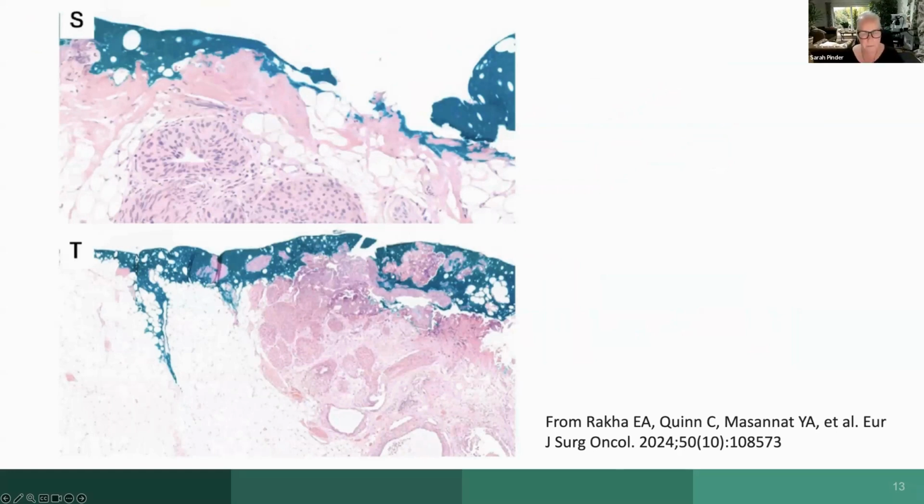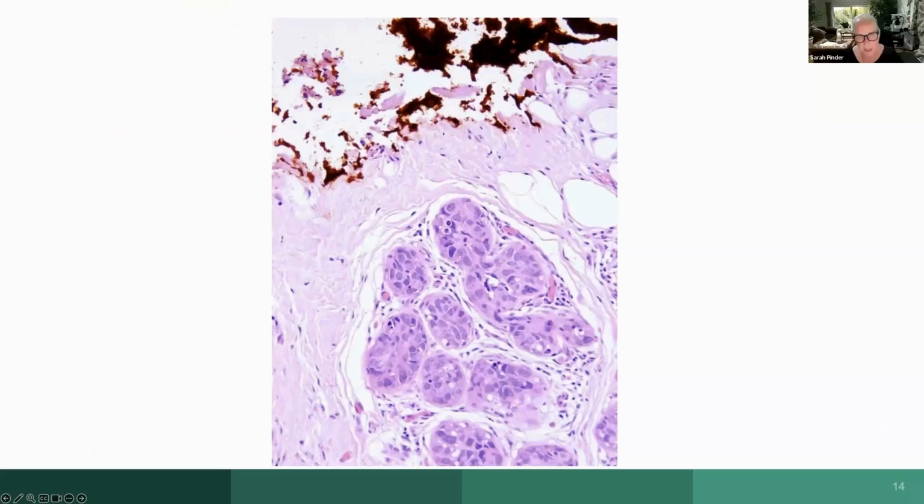And in terms of not at ink, measuring, again, we've got one more issue to deal with, which is, here's a case of high-grade DCIS in a lobule, so cancerization. Where should the pathologist measure the margin to? Do you measure it where it's sneaking down between the fat cells and the edge here? Do we measure it somewhere in between, or do we measure it to the outside of the ink? And that's going to give you quite different measurements again. So the question of what is not at ink is not actually as straightforward as one might at first think.